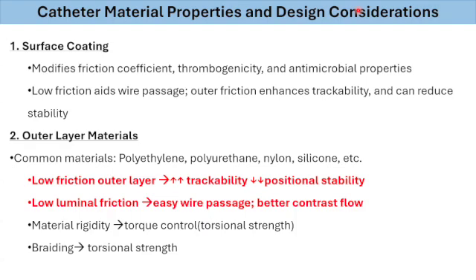Okay. Now coming to braiding. What is braiding? Companies have come up with a property called braiding. If you cut this catheter, most of the catheters have braiding inside it. So they have steel braiding or nitinol braiding. This braiding provides stability and strength to the catheter so that it can be pushed over a guide wire. Now the braiding can be of multiple types. It can be single braiding and double braiding. It can be of different configurations, helical braiding, box braiding. We don't need to remember all this. Just remember braided catheters are tougher and they are more pushable.